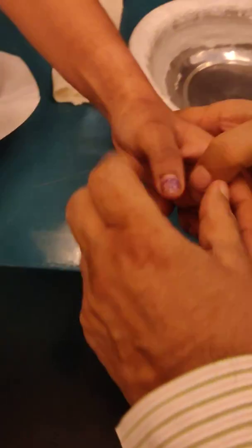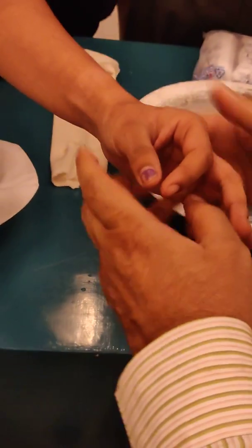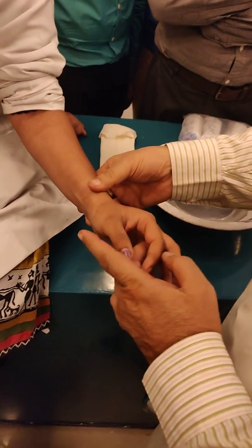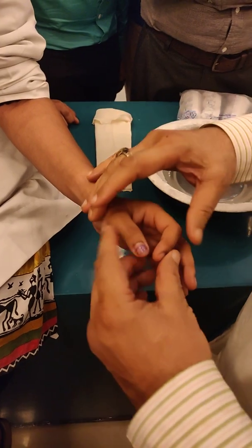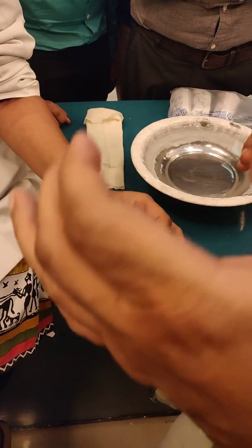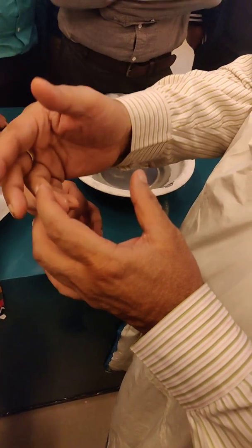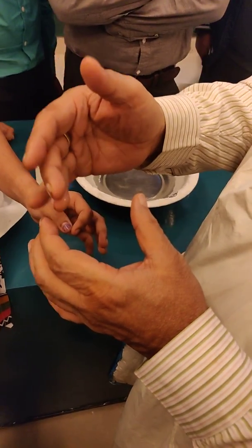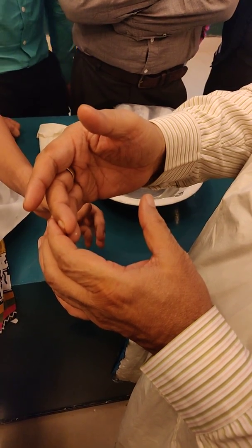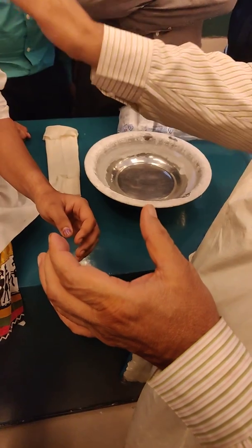We will give her a plaster in pen-holding position, and we will dorsiflex the wrist a little bit. The scaphoid has got a head, a waist, and a body. The body can fracture — it has good vascularity and has a 90% chance of union, as in this case.